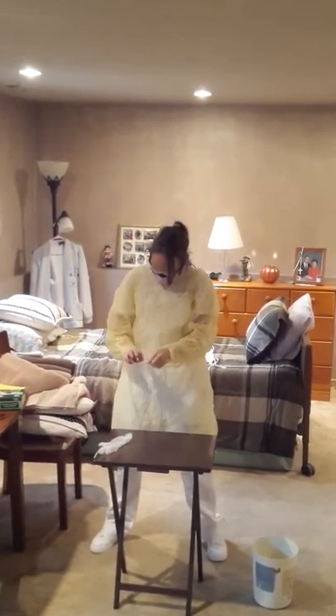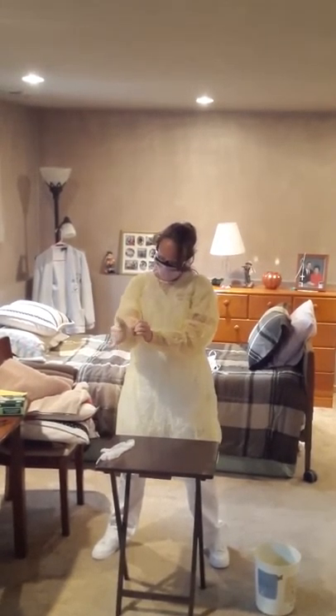And last, you will put on your gloves and you want to make sure the cuffs of your gloves are over top of your gown.